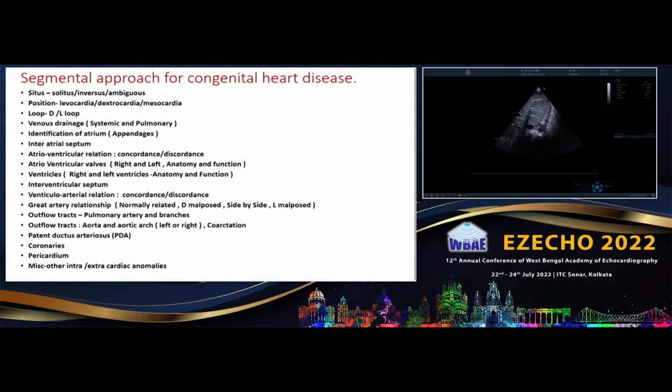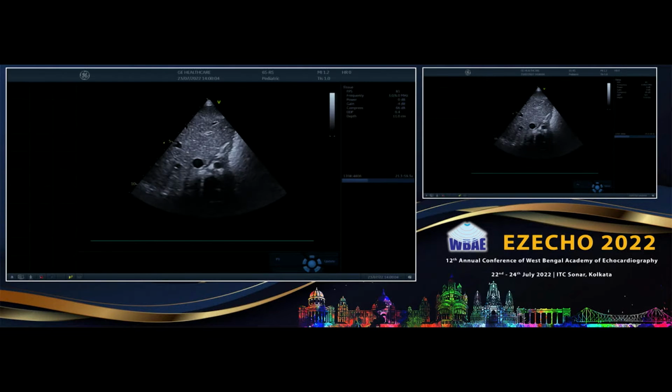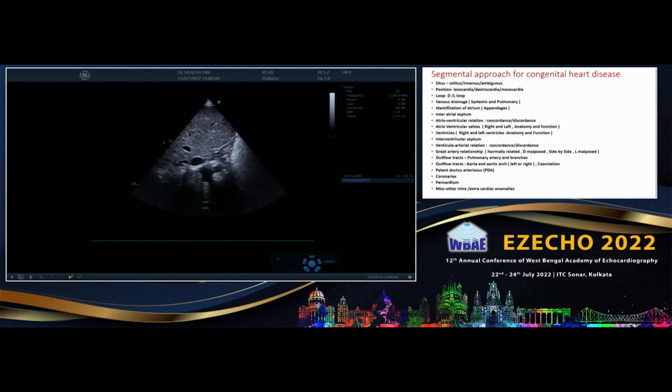So first of all, we will start with the... One second. May I request the screen of the echo to be bigger and this to be smaller? Thank you. Yeah, and the slide can go there.